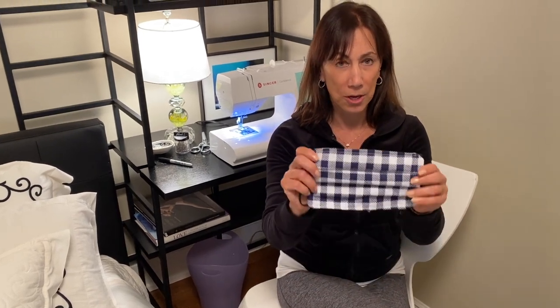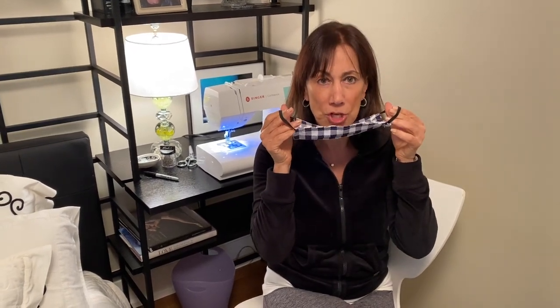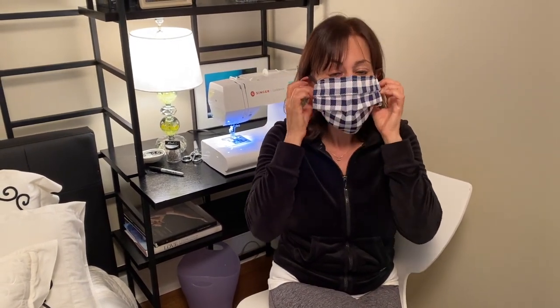I'm going to walk you through how to make a mask at home. While you do need a sewing machine to do this, I'll tell you where the non-sewers can also participate. The final product is going to look like this: a simple mask with elastics on either side that go behind the ears, goes under the chin, and rests over the nose without covering the eyes. As a surgeon, I feel like I have the inside information as to what we're looking for in a mask.